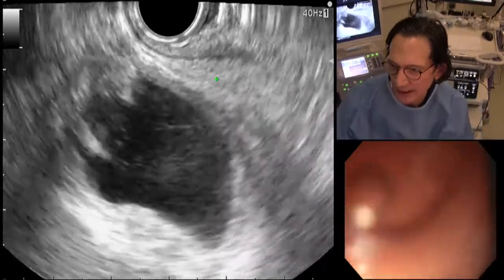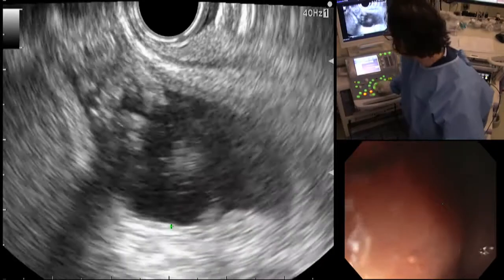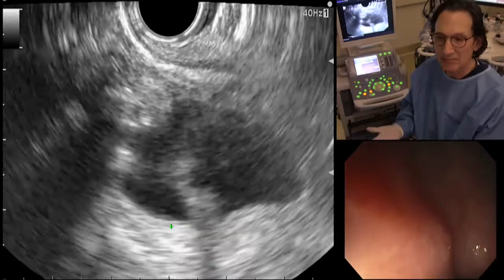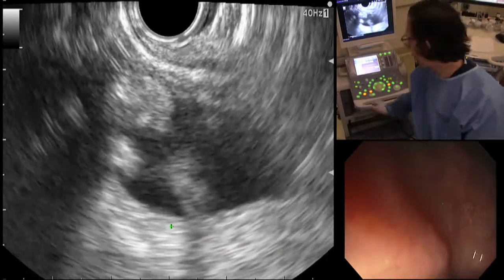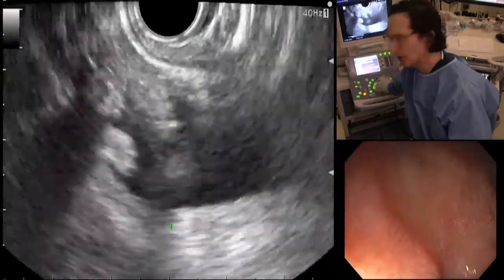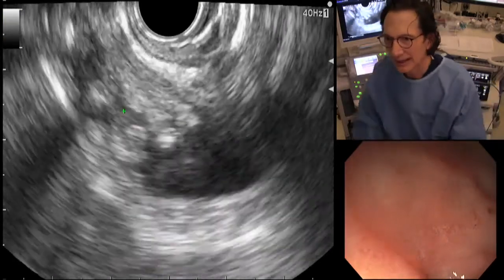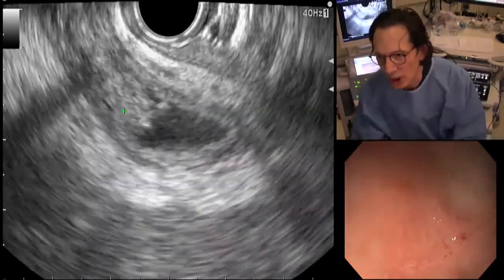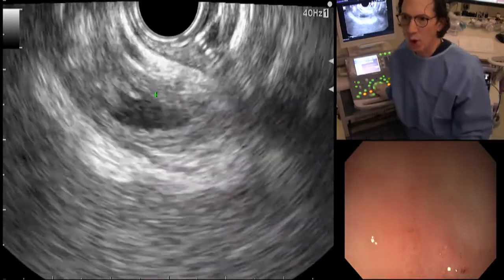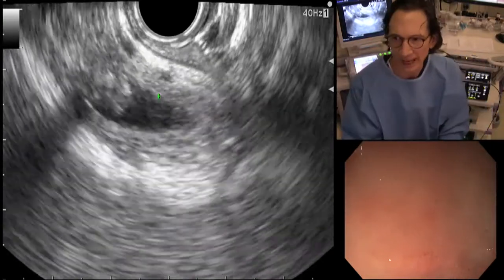So we see here a structure that's filled with some fluid, which could be the gallbladder. Now, we have to be careful that we don't know that there might not be a biloma. There might be a fluid collection outside of the gallbladder, so we want to be sure. Now, first we'll switch on the Doppler to be sure there's no Doppler signal. There is none. We do see a bunch of material here, that would be consistent with sludge and stones. It's shadowing as well, right? It's right adjacent. It does have a wall. We see that here. There's a wall. It's a thickened wall. That's consistent with the gallbladder, all right?